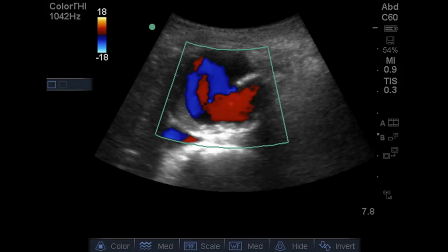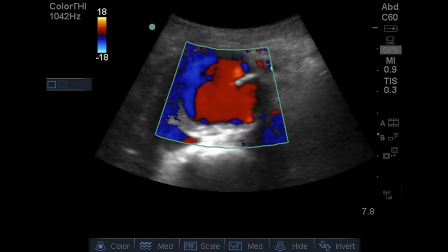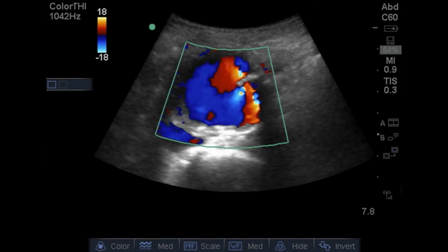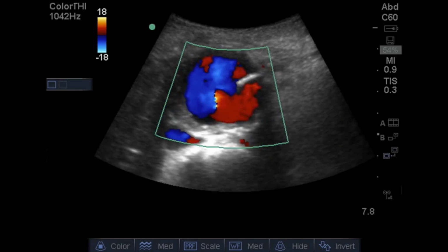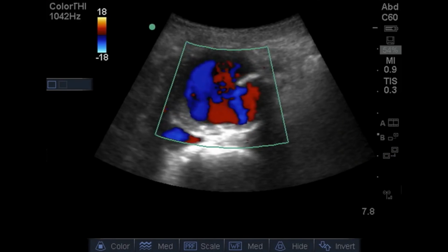You can see here in this ultrasound image of an aorta with bidirectional flow, you can see that there's red and blue flow as the blood is swirling around in different directions in motion towards the probe and away from the probe. Remember, the color does not denote arterial or venous flow, but rather direction related to the probe. By convention, we try to make arteries appear red and veins blue. However, this is merely by position.